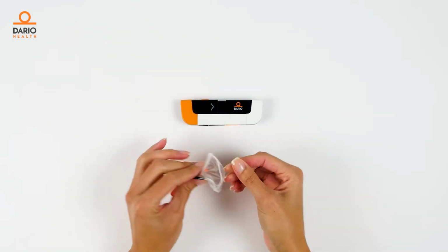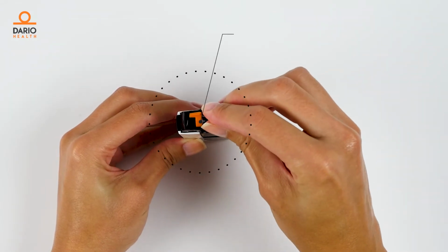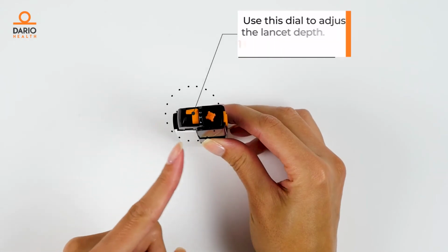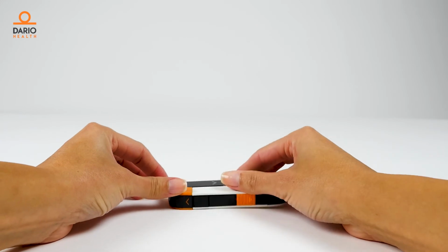Next, remove a sterile lancet. Open the orange lancet cover and carefully insert the lancet into the slot as far as it can go. Twist off the lancet cap. Turn this dial to adjust the lancet depth setting. 1 is the shallowest depth, 4 is the deepest depth. Snap the orange cover back on.